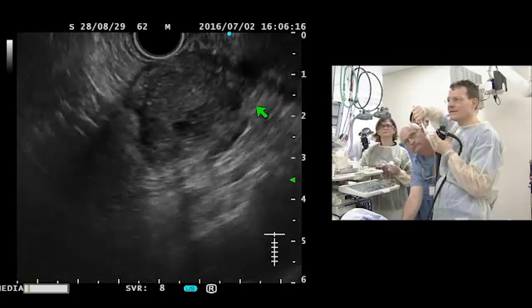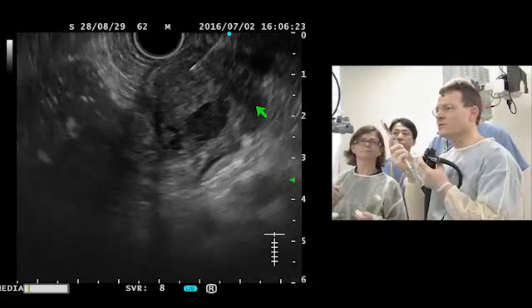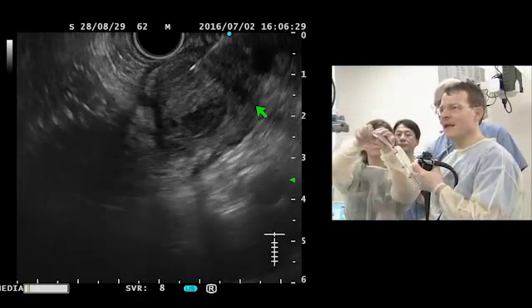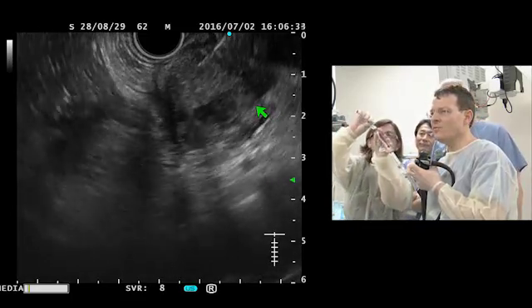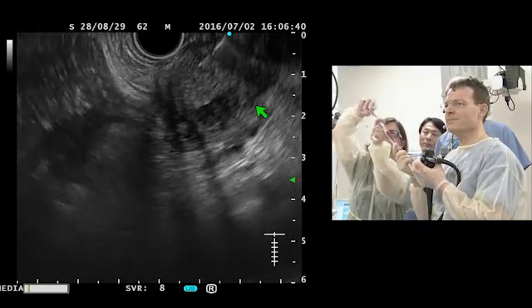So I'm sucking, and now I'm in, but you see the needle is bended a little bit, but I think it is okay. We are inside the lesion. Now we are going to retract the stylet. And now I push the scope a little bit in. I know I have a more bended position, but stability is here the most important.